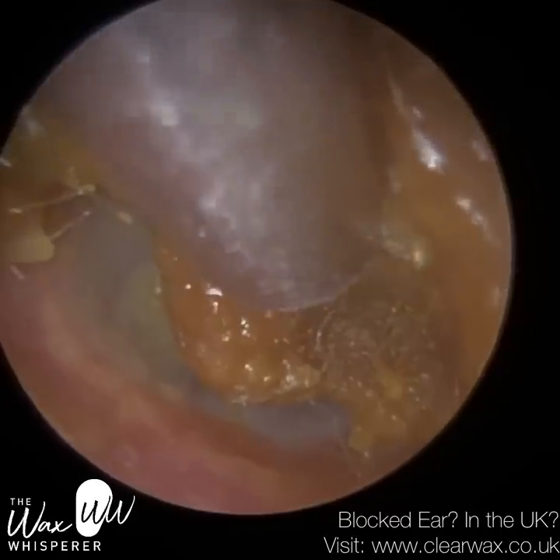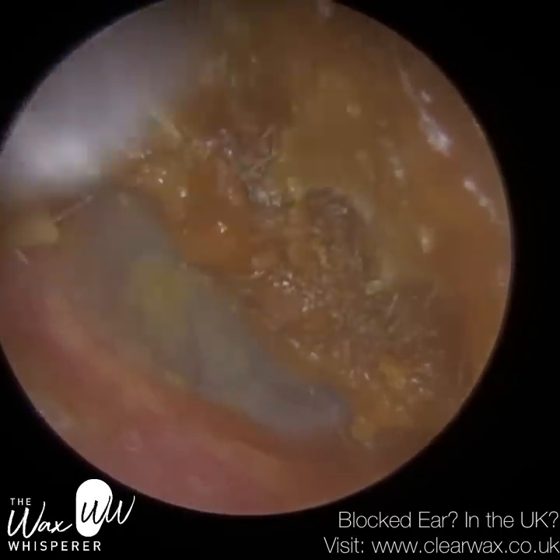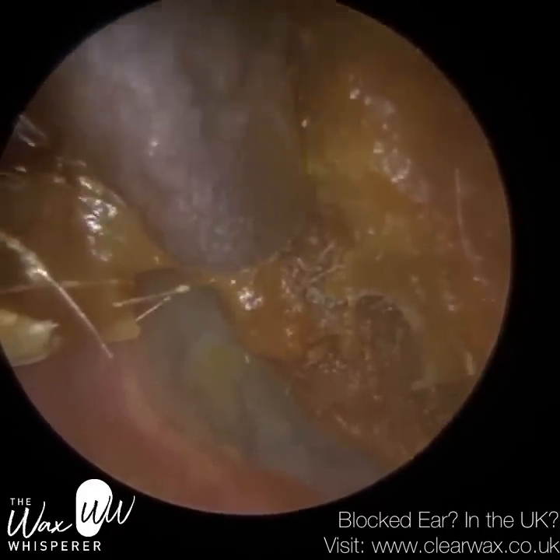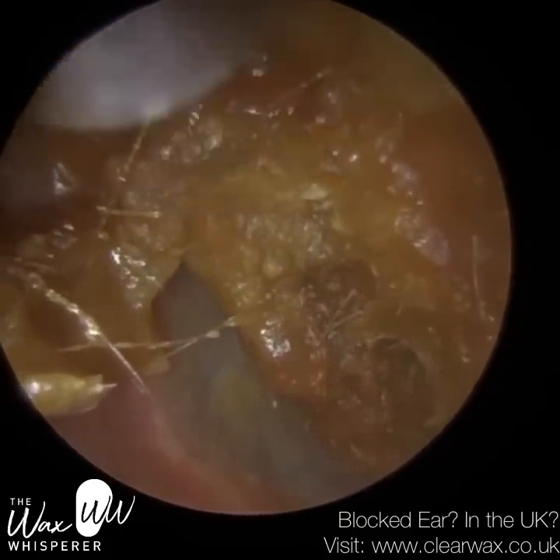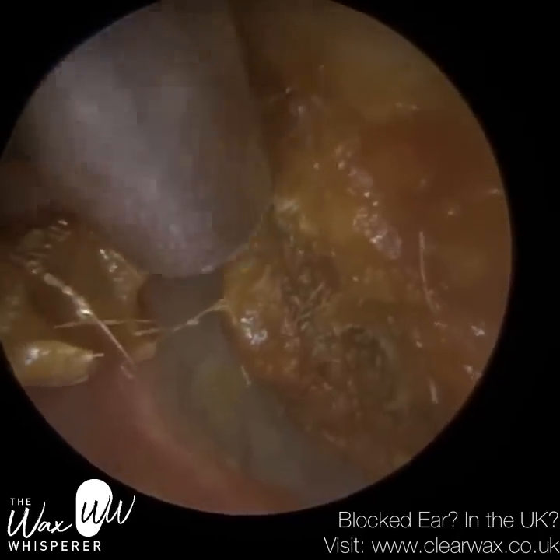This patient does suffer from chronic impaction of wax and dead skin. They last attended in June last year — approximately nine months ago. Prior to that, they attended a year earlier. They are in their early 30s, and it's just been in the last few years that they've begun to experience issues with wax and dead skin buildup. They do also suffer from very mild otitis externa.